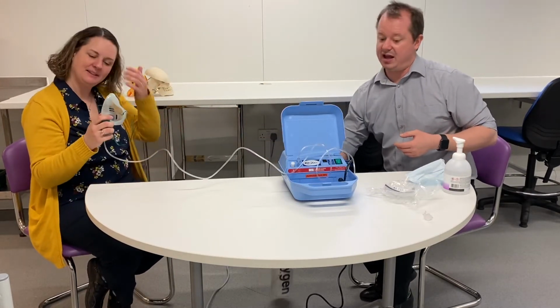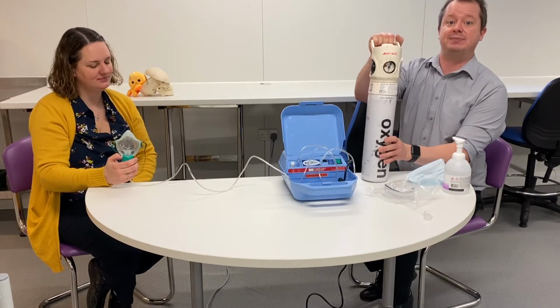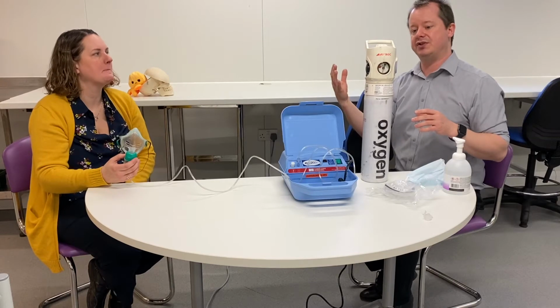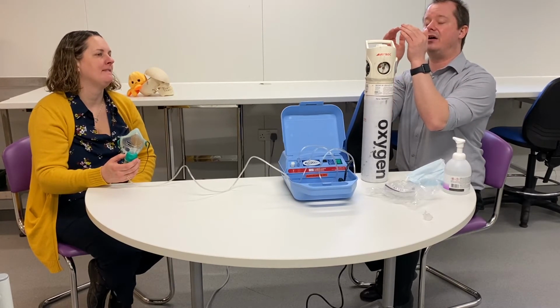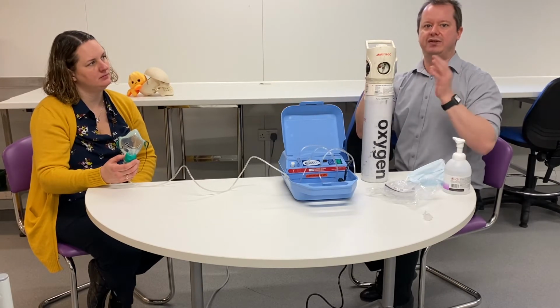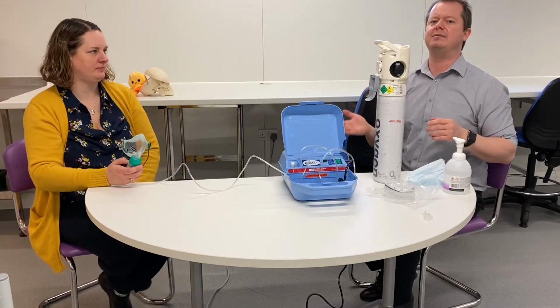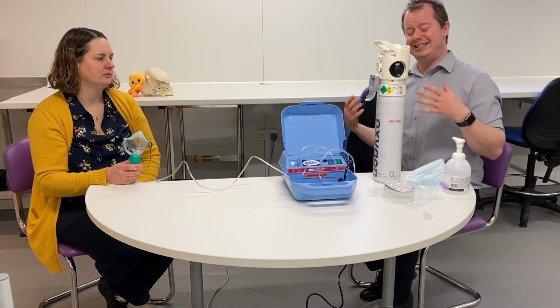If your patient requires oxygen therapy, they might be having it via nasal specs, which is absolutely fine. You can just leave those nasal specs on at the rate they were, and put the mask over the top of them. However, if they're having oxygen via an oxygen mask, you will need to drive the nebulizer with oxygen. The only issue is that you have to give a minimum of 6 litres per minute through the nebuliser to create the vapour.